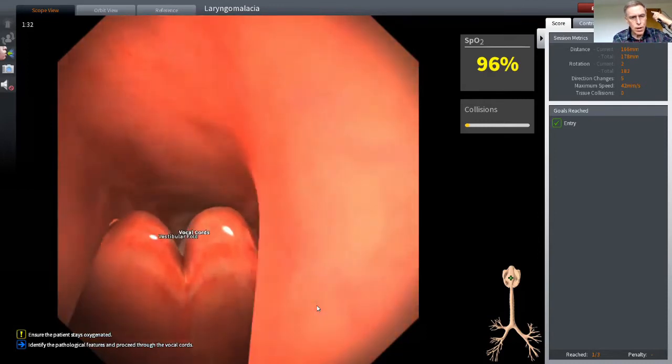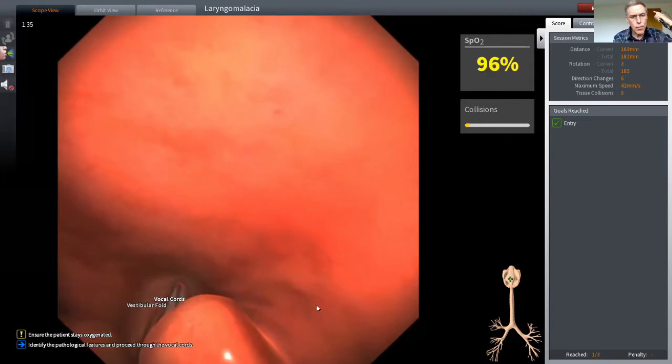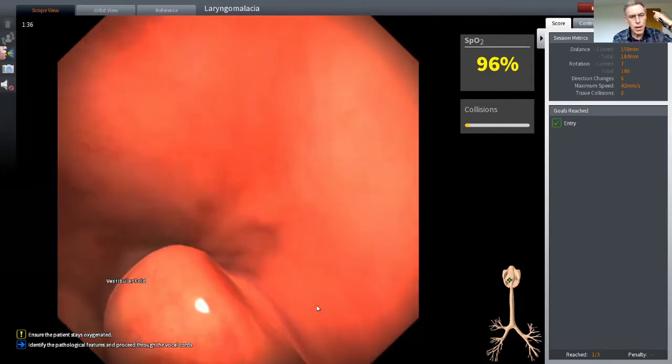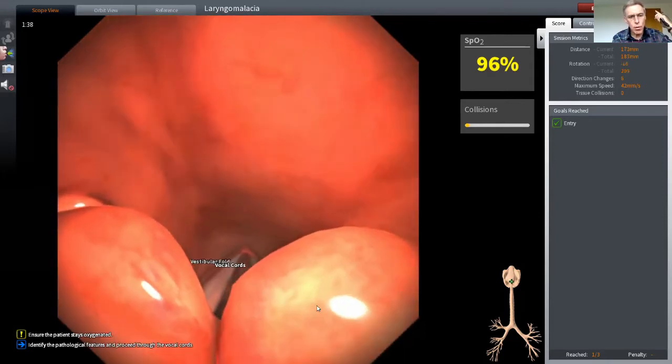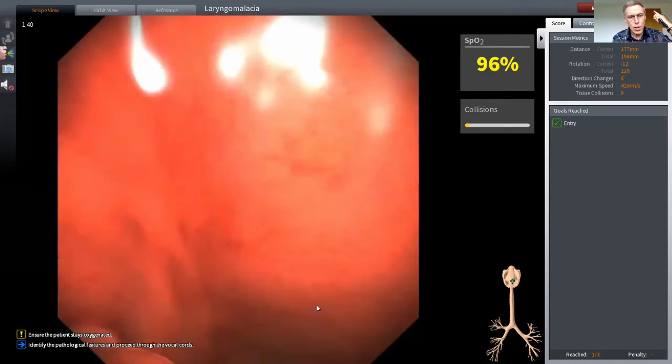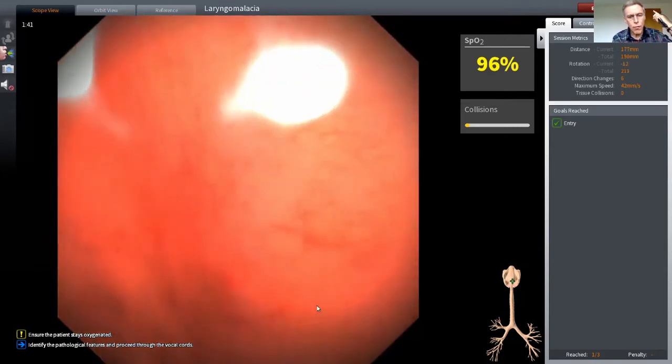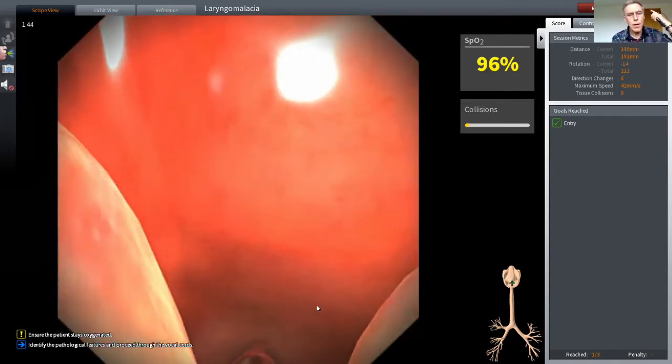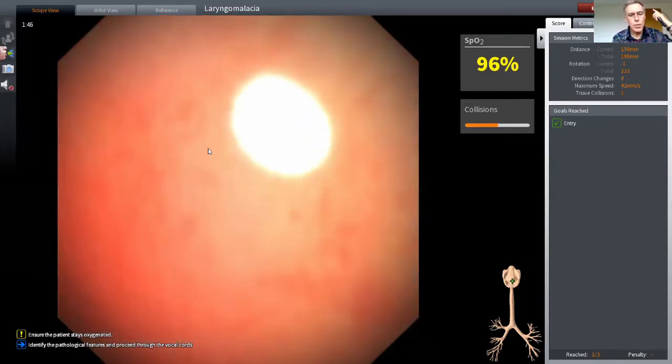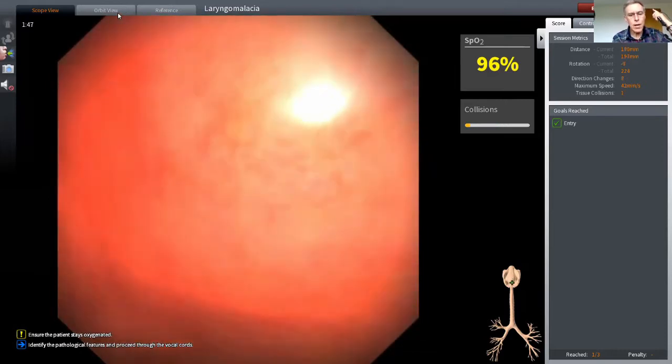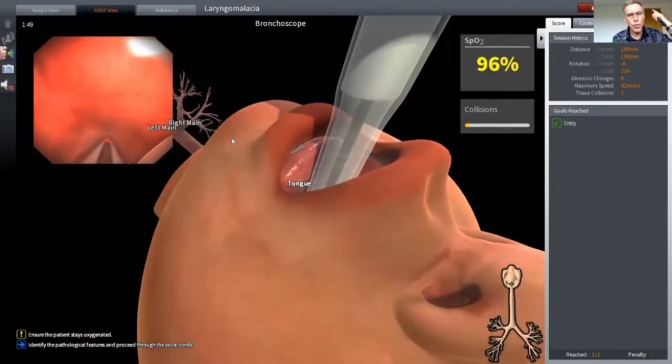So I'm going to move my bronchoscope now over the top of the arytenoids, and also I'm going to move to the orbit view, which is a great way of looking at the anatomy. Right, so we'll just do that now, switching to the orbit view.